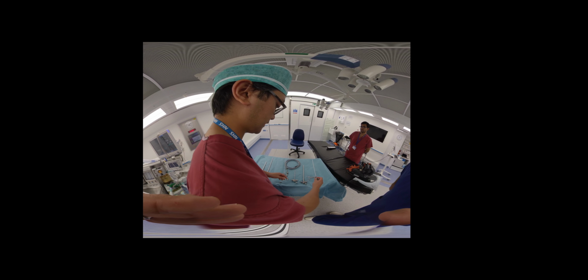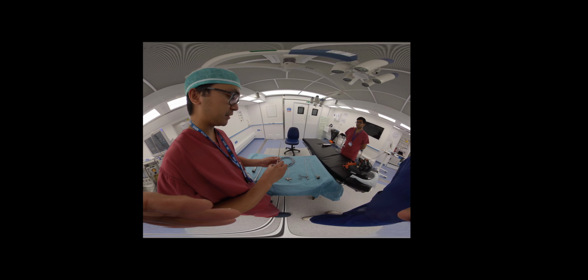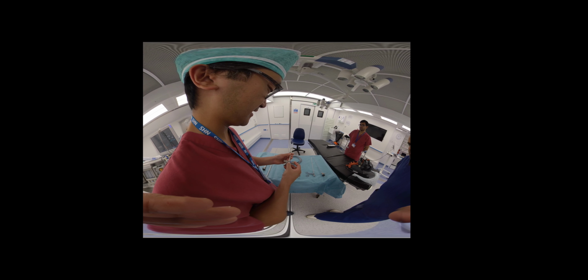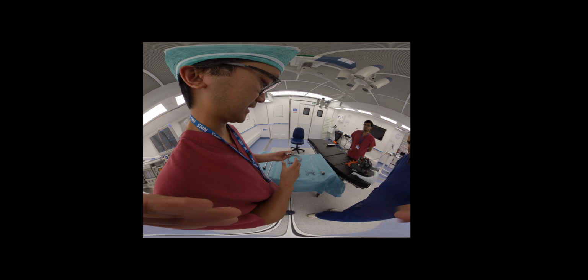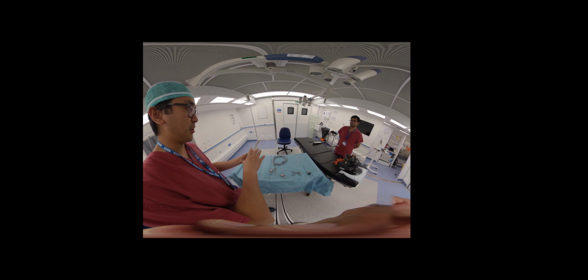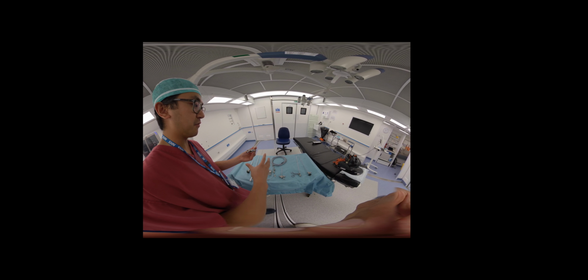Onto the bronchoscope itself. So we'll take this out for now. So this is the paediatric bronchoscope. Once you've got the right size, this is a ventilating bronchoscope. So the orientation should be like this, okay? So the bevel is on the right side, and the reason it's called ventilating is that the anaesthetic circuit is on your left side if you're facing the patient, and you can ventilate the patient whilst doing your surgical intervention, whilst removing the foreign body.